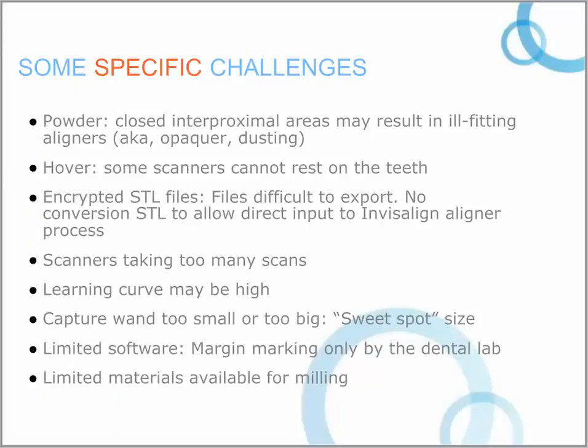The wand itself often has been critiqued, and we've got to think about the size of the wand, and I want to stay here for just a second and talk about wand size. The wand size is important. It can't be too small, and the reason for not too small is that when you press the wand against, for example, the buccal tissue to push the cheek out of the way, and it folds over top of the head, it makes it difficult to capture the information. The wand then can work like a really nice retractor.